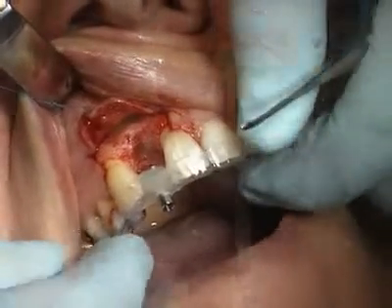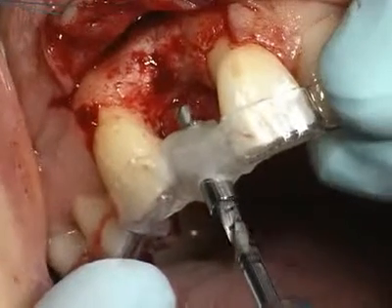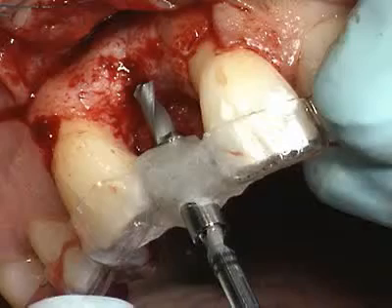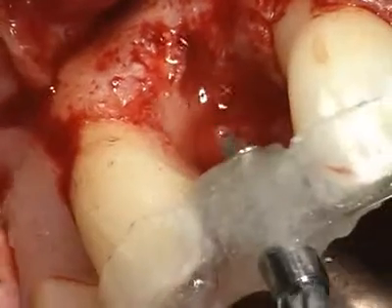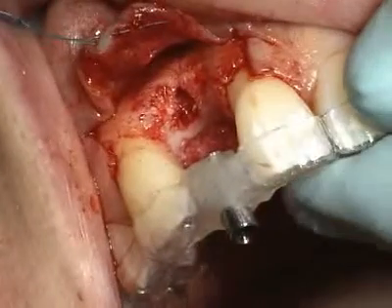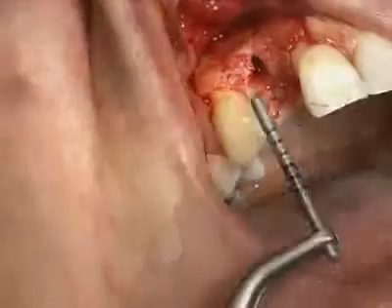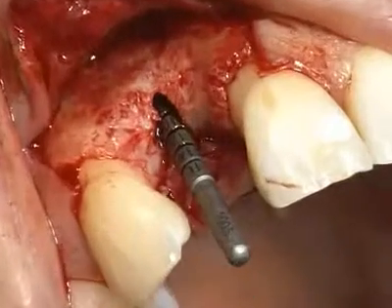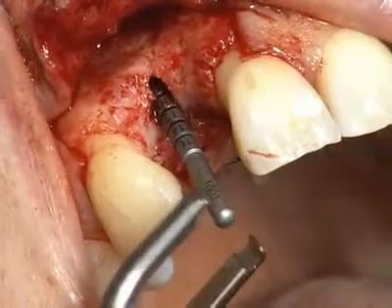Thus prepared, the implant bed is created in its definitive axial alignment with the first length-coded pilot drill with a diameter of 2.2 mm using a maximum speed of 800 rpm. All drilling is carried out with slightly intermittent drill movements and cooling with sterile saline. The planned axis direction is checked with a 2.2 mm diameter alignment pin. Besides the axis direction, the depth can also be verified.